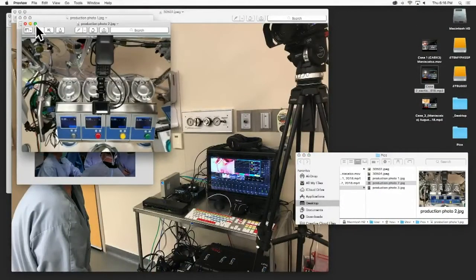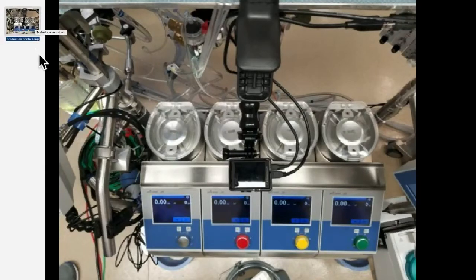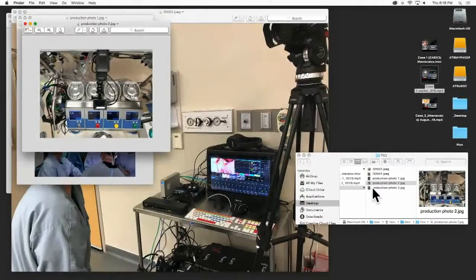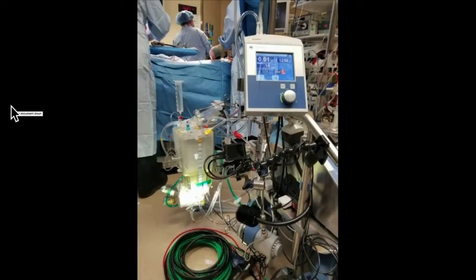And there's a picture here of one of the GoPros. That's the one you're seeing on the pump. We flipped that image over because it was upside down. We also ended up flipping the image of the heart, because that way you're seeing the perspective of what the surgeon sees, not what the anesthesiologist sees. I think that's all of our pictures. Oh, there's a picture of the GoPro that we have on the reservoir. So that's how we did this.